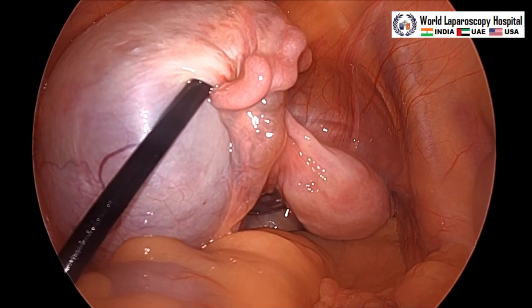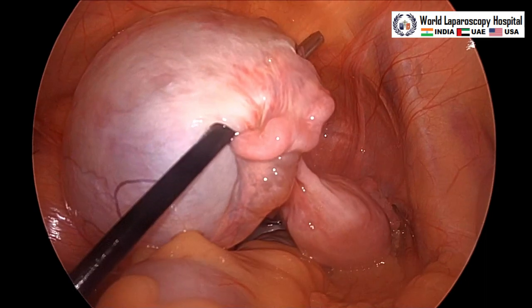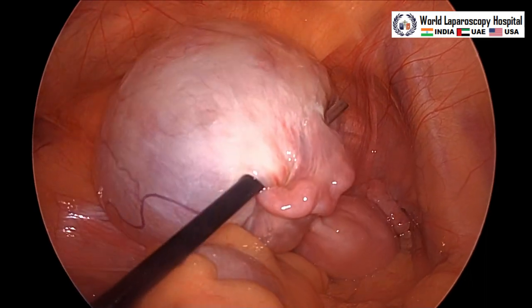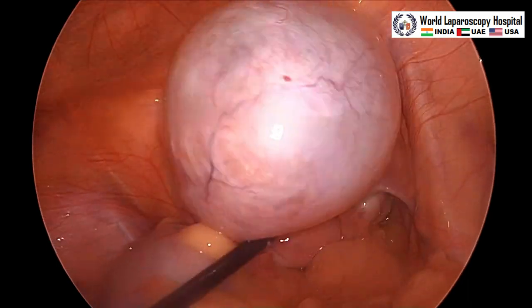We can see this is a left-sided ovarian cyst, but it has a little torsion and it is reaching to the right side. First we will do the aspiration and then detorsion will be performed.